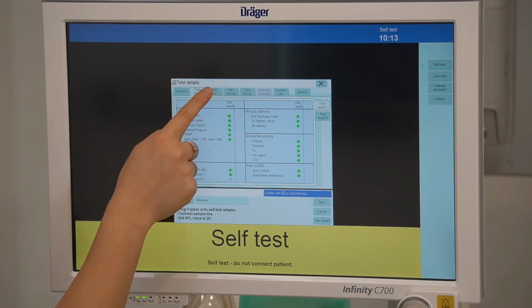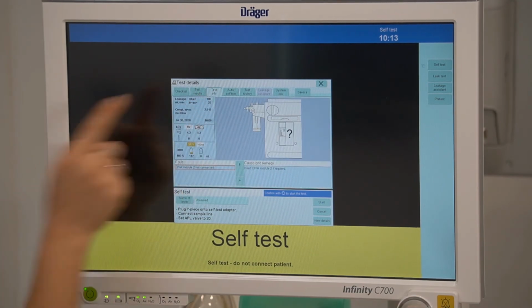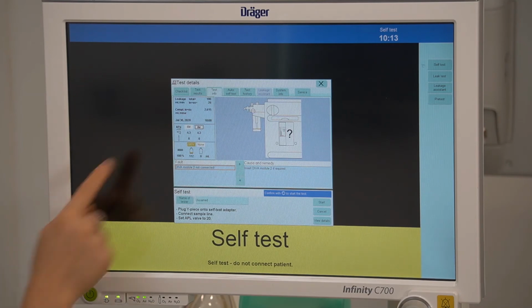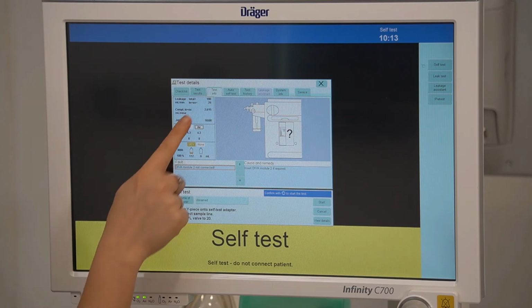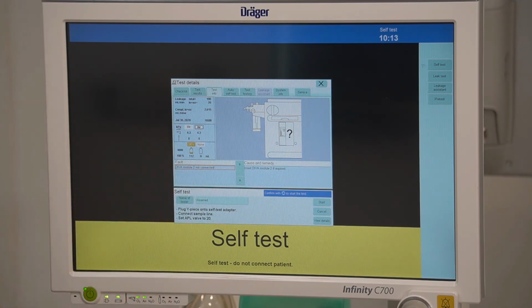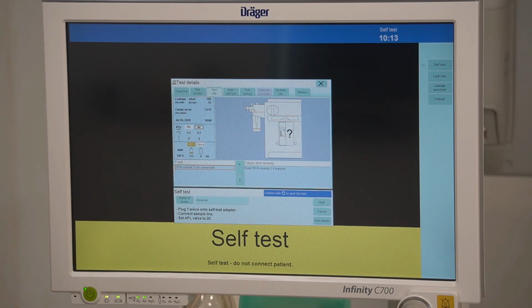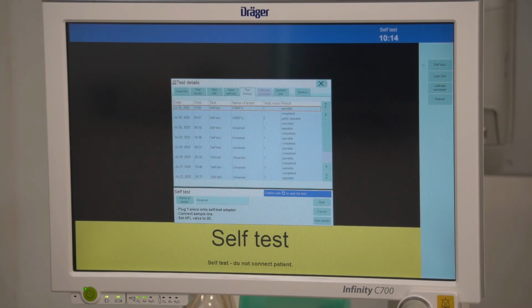The pre-test will begin with most frequent errors tested during this time, such as a large leak, a Y-piece not properly occluded, or an incorrect APL valve setting. Pre-test usually takes approximately 1 minute to complete. If a problem is detected, the pre-test will pause and a highlighted image will be displayed, alongside a fault and a possible cause and remedy.